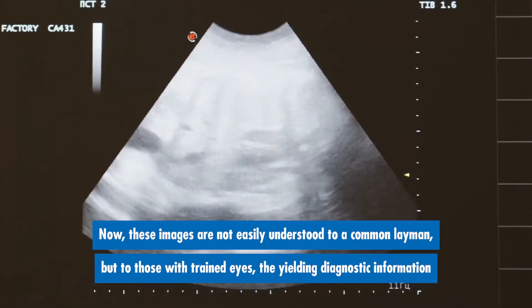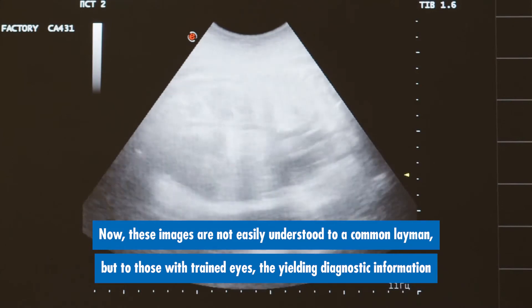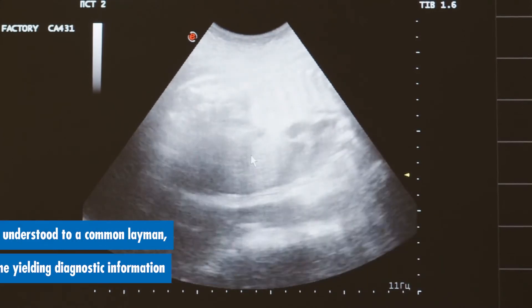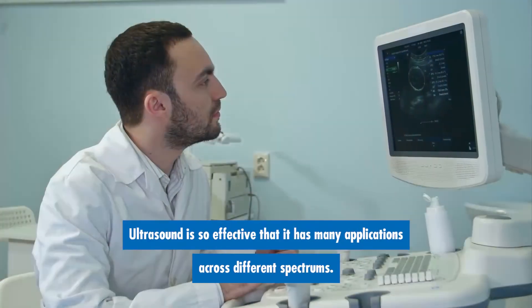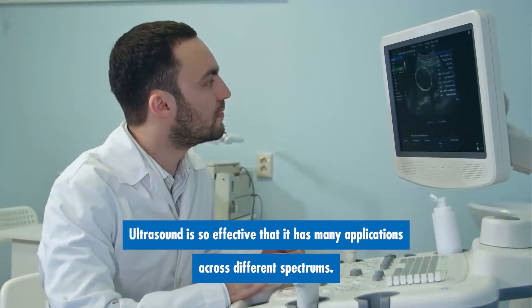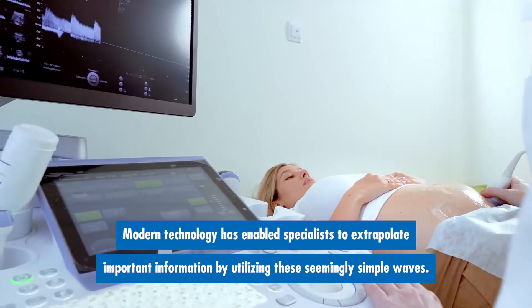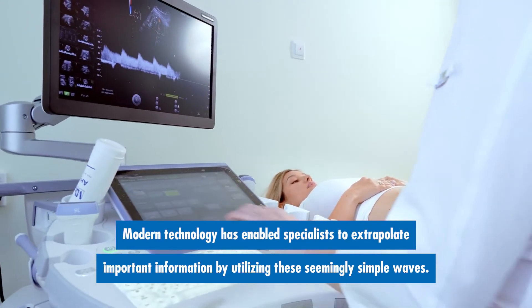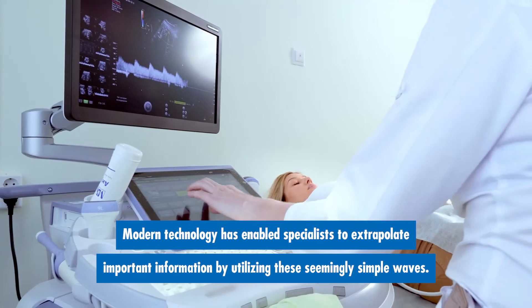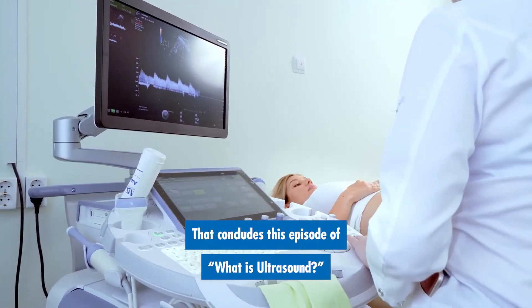These images are not easily understood to a common layman, but to those with trained eyes, the yielding diagnostic information can be extremely useful. Ultrasound is so effective that it has many applications across different spectrums. Modern technology has enabled specialists to extrapolate important information by utilizing these seemingly simple waves. That concludes this episode of What is Ultrasound?